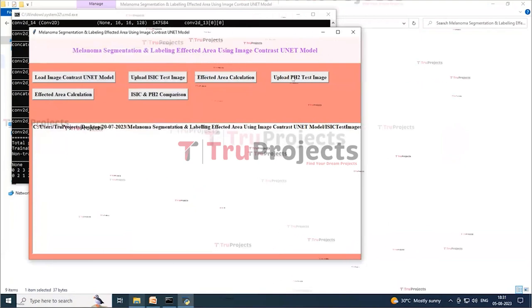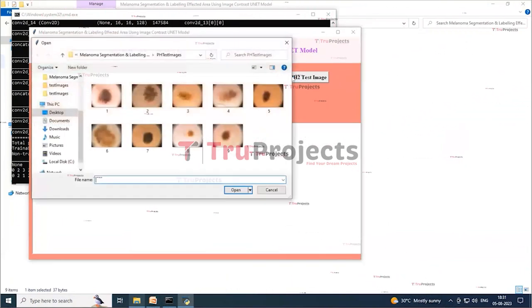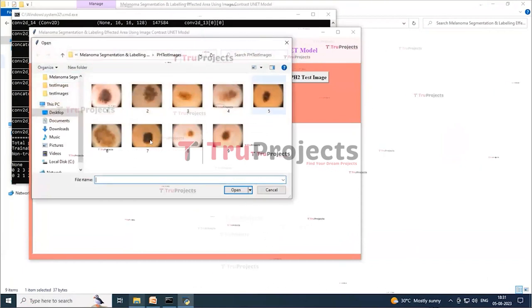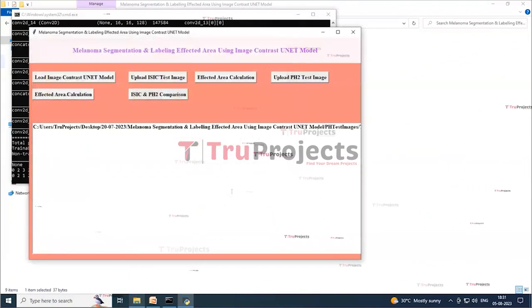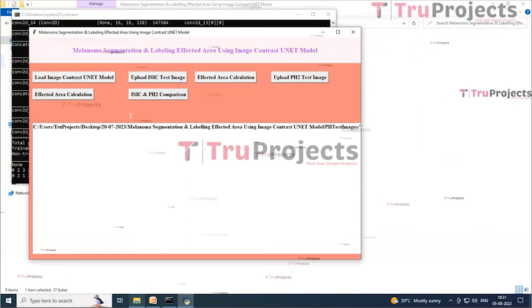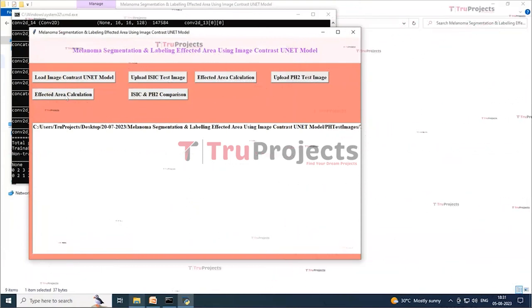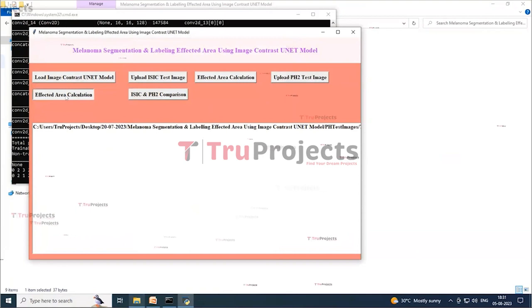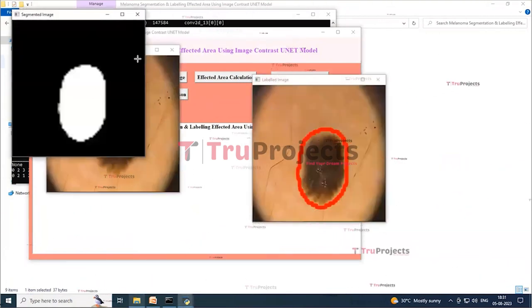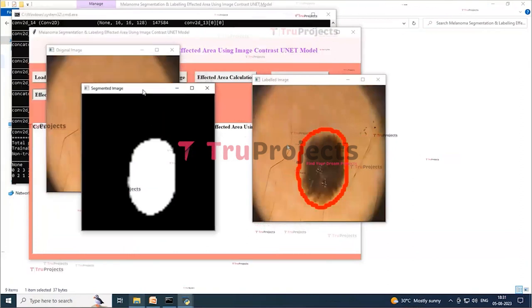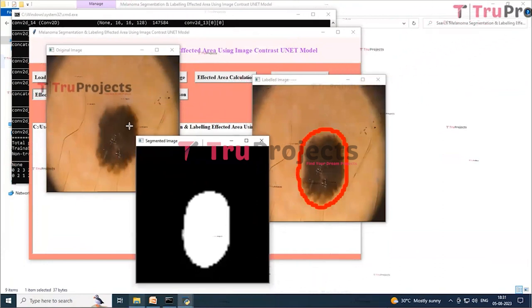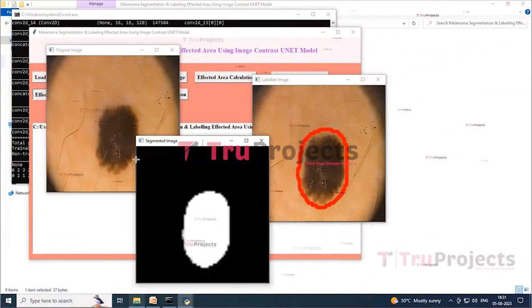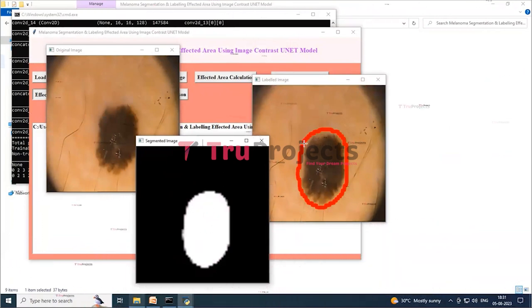Next, click the Upload PH2 Test Image button, select an image, and click Open to load it. The image loads on screen. Then click the Affected Area Calculation button to get the output. Two images are displayed: the original image and the segmented image of the original, along with the labeled image for the segmented region. We then close these images.